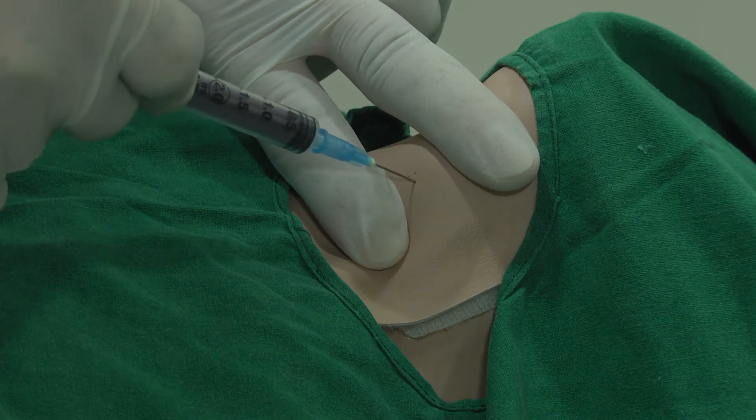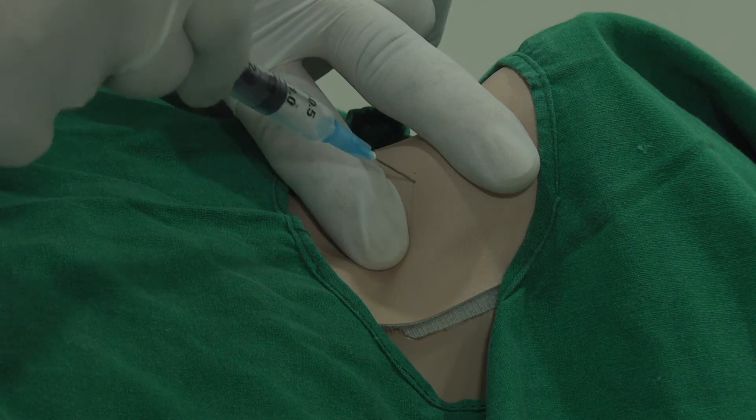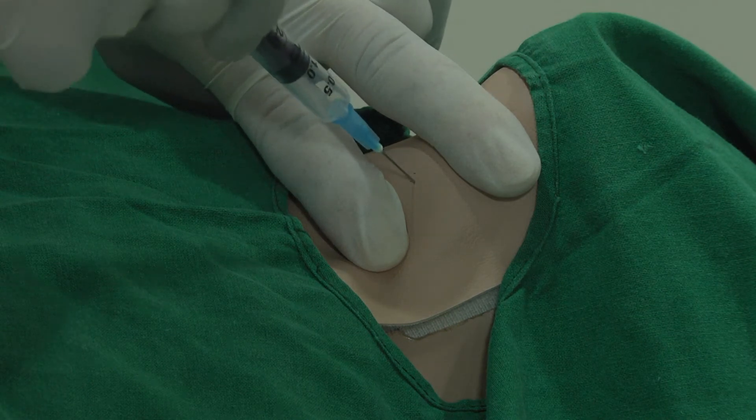The needle is inserted into the nodule. Negative suction is created. Multiple passes are made in different directions, fixing the nodule with two fingers and requesting the patient not to swallow, as the nodule will move.